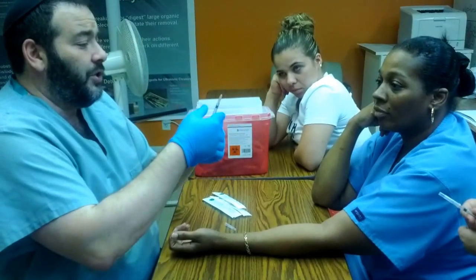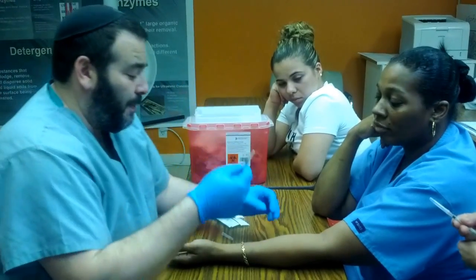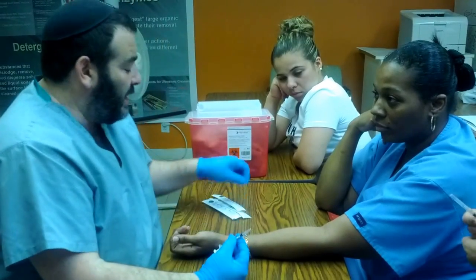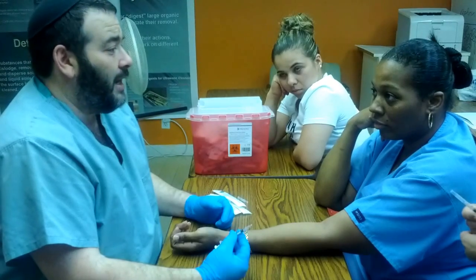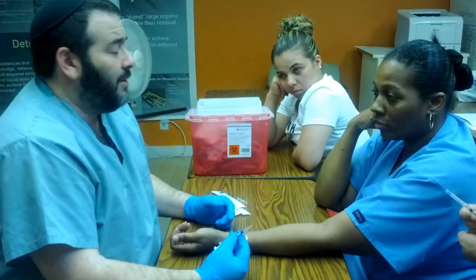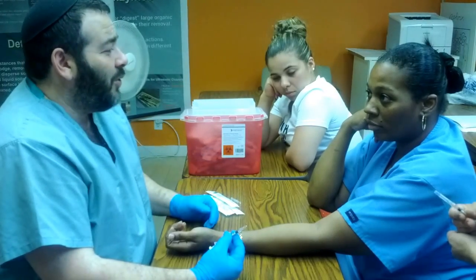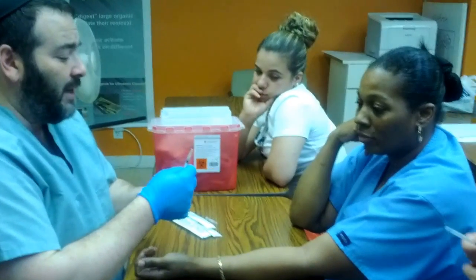Grab your syringe just like so with these three fingers, somewhere halfway down the barrel. Now we wait for the alcohol to dry. The longer the alcohol stays wet, the more disinfected the site of injection is. Don't try to wipe it with gauze or blow it with your hand. These are all mistakes that people make — make sure the alcohol dries by itself.